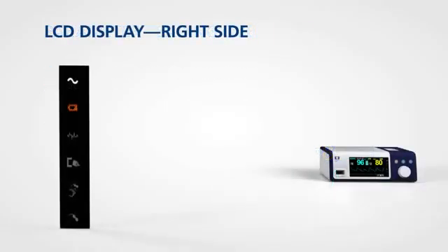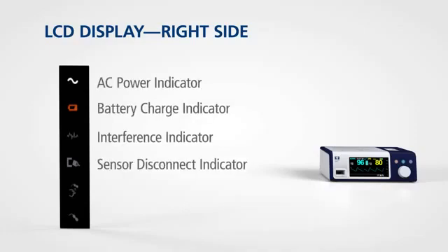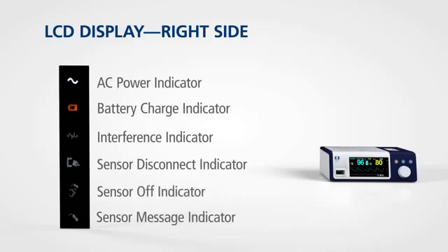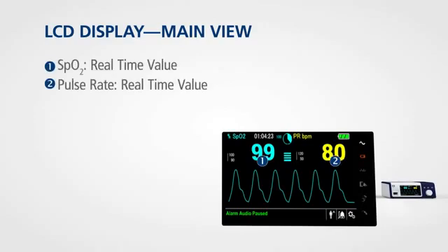On the right side of the display, icons provide information on the status of the monitor. These include indicators for power, battery charge, interference, sensor disconnect, sensor off, and sensor messages. The main view of the LCD presents the real-time values for SPO2 and pulse rate in prominent numbers that can be read at a glance.